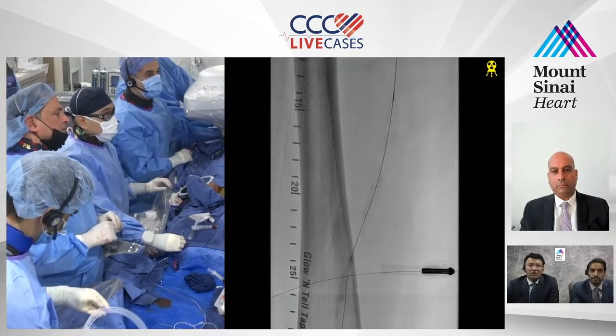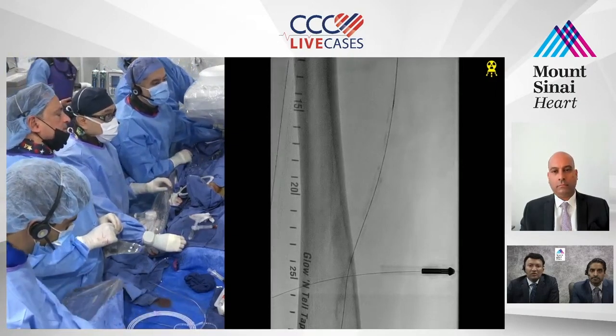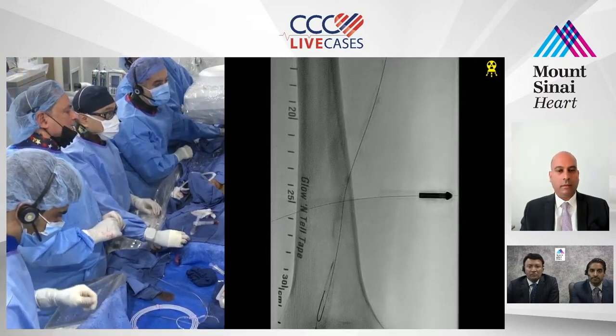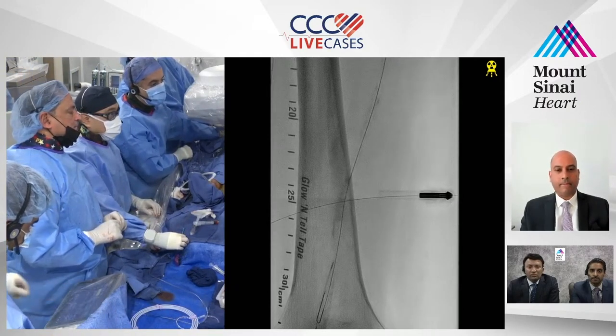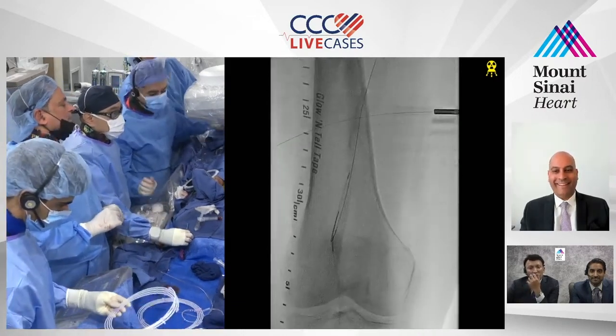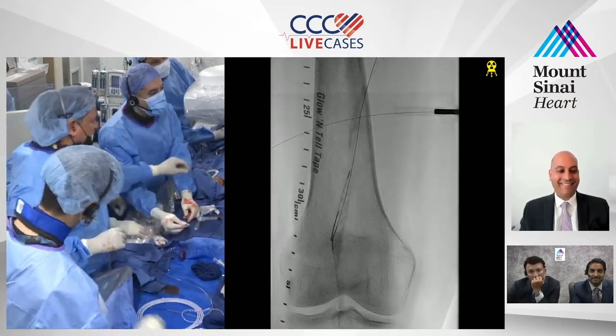Did you guys cross already? Looks like you crossed, right? Looks like it. Yeah, I don't know. Push a little more. I think you're going to cross. You want to try something more? Yeah, you're going to cross the ballooned area. Good. Wait, hold on. Let Ray and I pull this back a little.